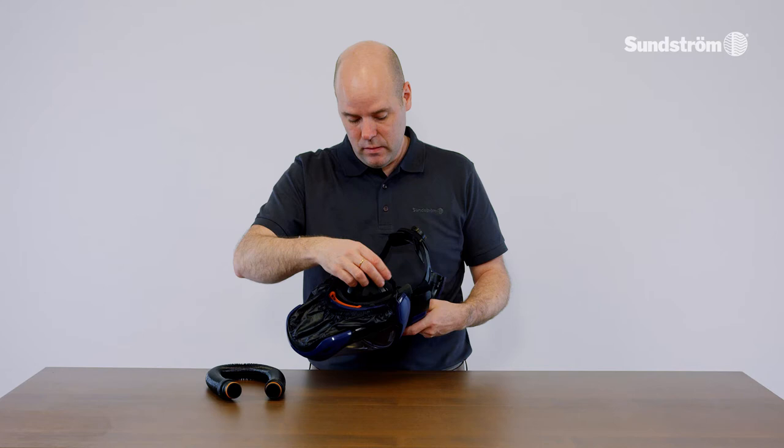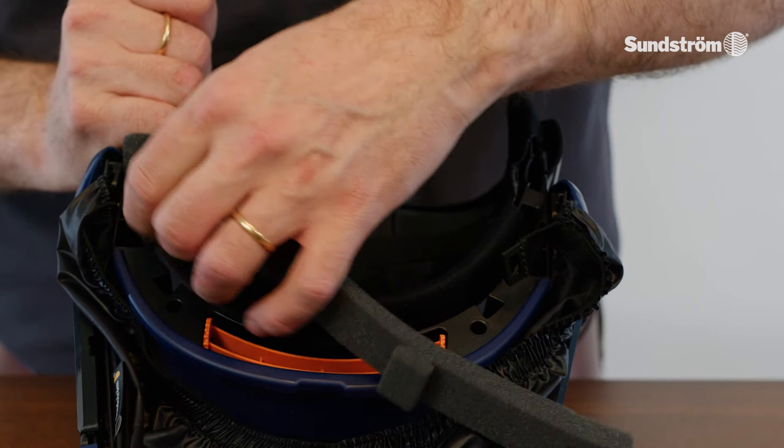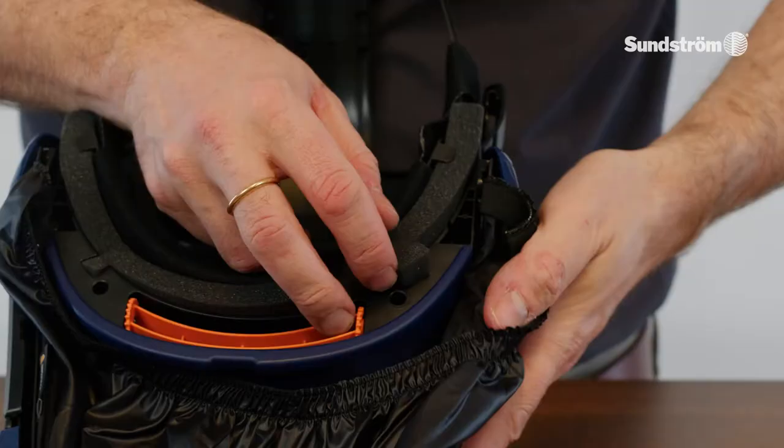Change the head harness seal. Release the face seal hooks. Remove the head harness seal. Fit the face seal to the sides of the head harness.